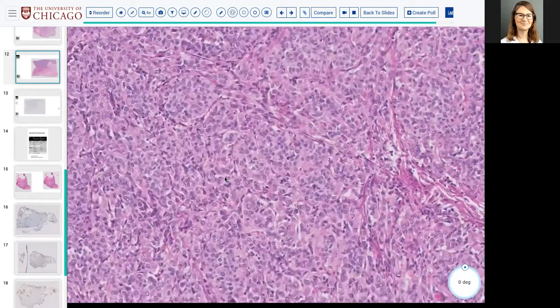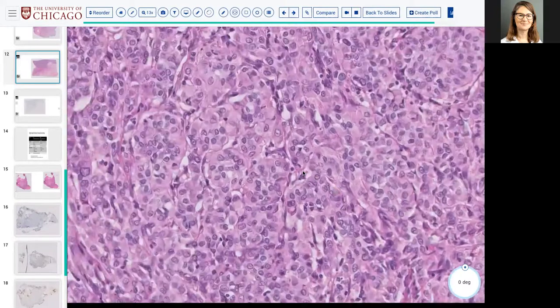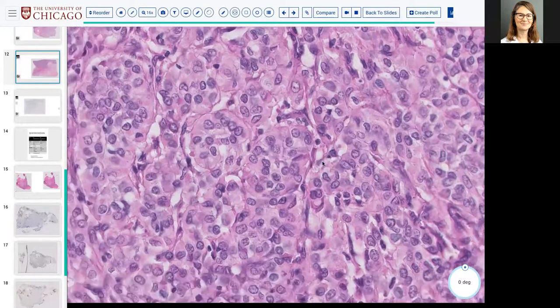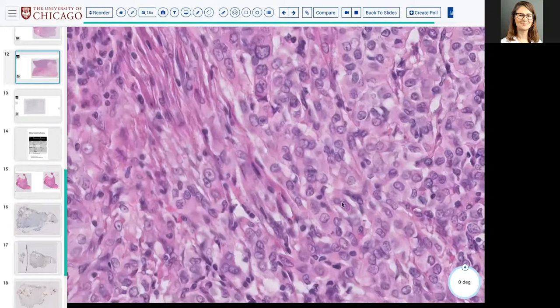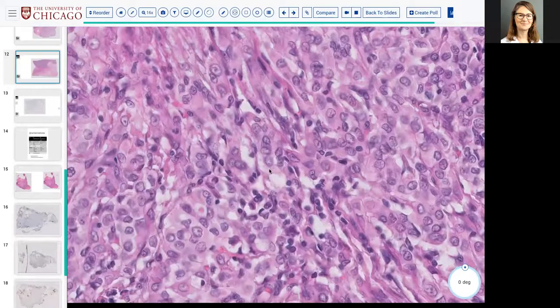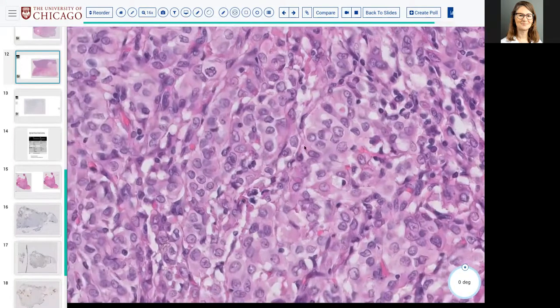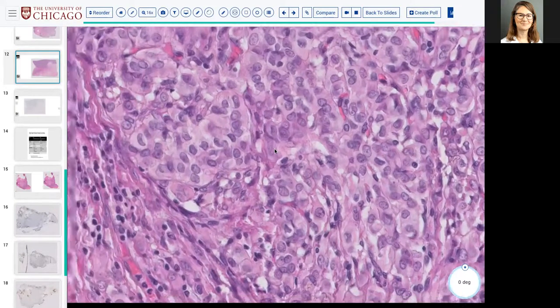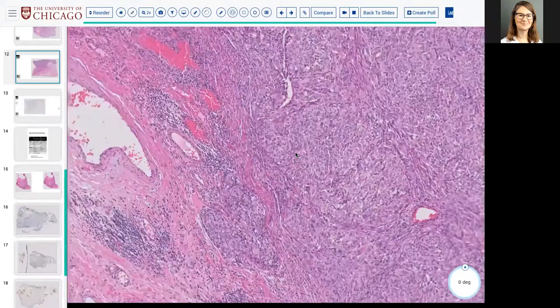This has, one might argue, still some evidence of PTC nuclei with inclusions, with clearing, with overlapping, with irregular borders. So these to me aren't those dark raisinoid nuclei of convoluted. These are more of the open, large, almost voluptuous nuclei of papillary carcinoma. And you might argue that we've seen at least one pseudo inclusion.